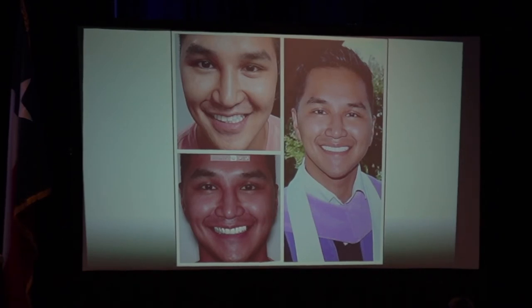I'll invest in the technology, make it easier. The designer is going to spend 1 hour, 2 hours, 3 hours, 4 hours designing the case. Gives me back the models. I transfer the models to the wax up.